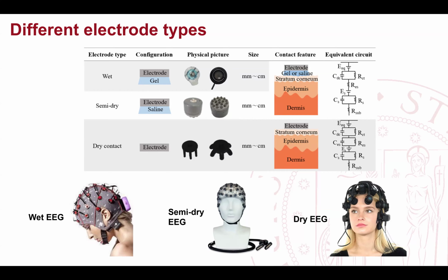They are long lasting. I used them in an experiment for 3 hours without any loss of signal, so they work very well. There are still some problems in the way, so still it's not as good as a wet, but again, it's a good compromise. So we are now moving to this system rather than this one, because this one for us is impossible.